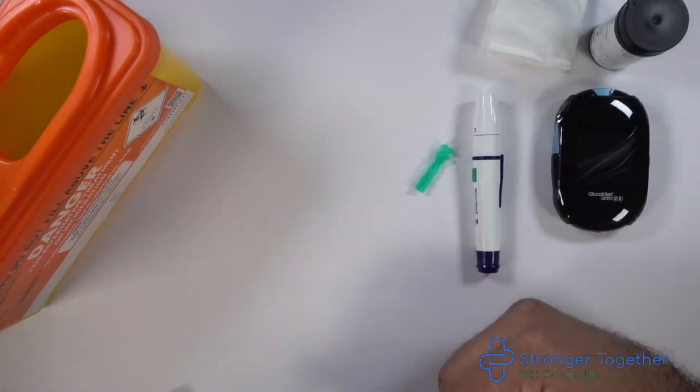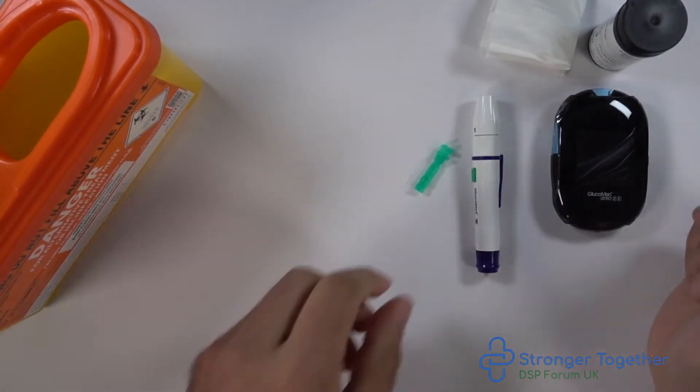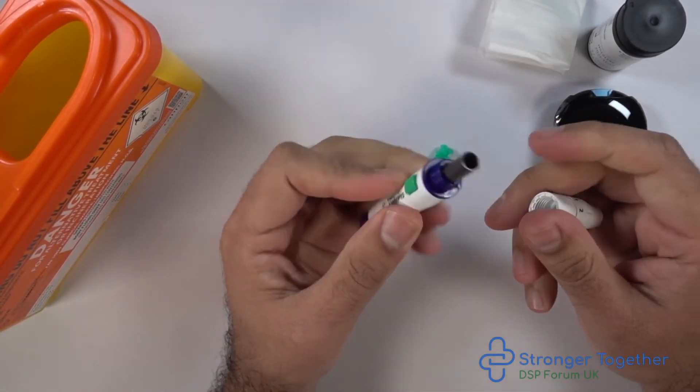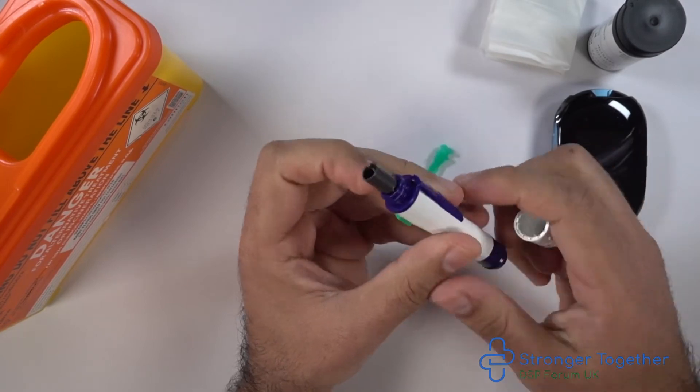We made a separate video with detailed instructions and a demonstration on how to load this lancing device safely and discard the lancet. If you want to see that video, click the link above on the screen now.